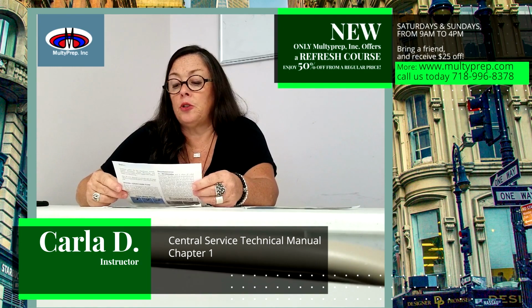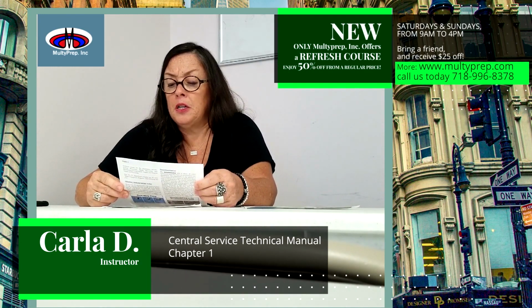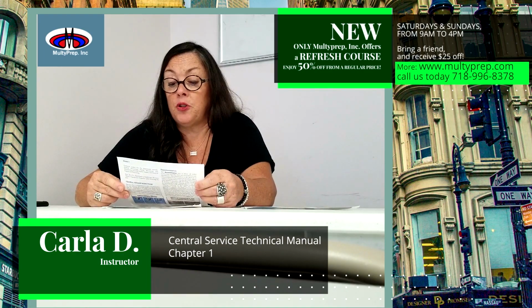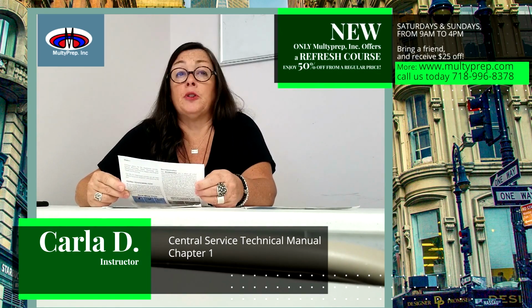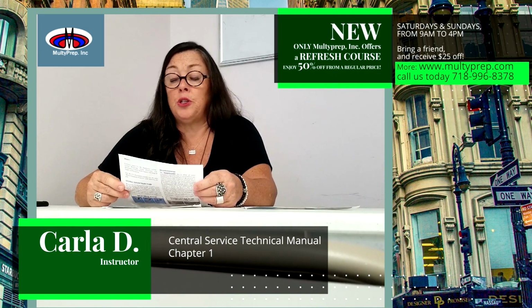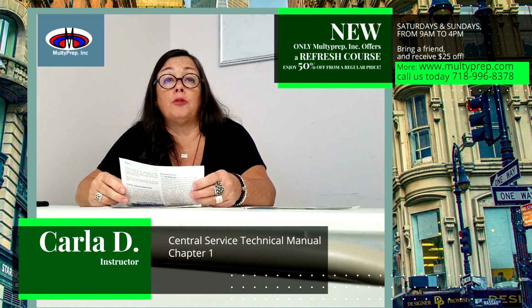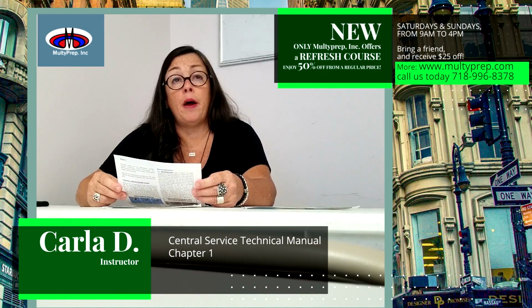When services are centralized, when the most effective processing equipment is used, and when a better educated and prepared workforce is available, staff can process a greater volume of materials in less time. This helps to meet the demands of increased workloads in today's healthcare environment. The service in Central Service. The term service is the key to what Central Service is all about.